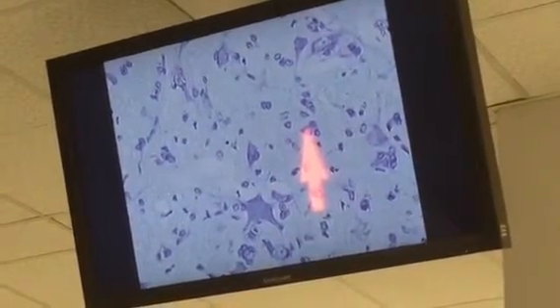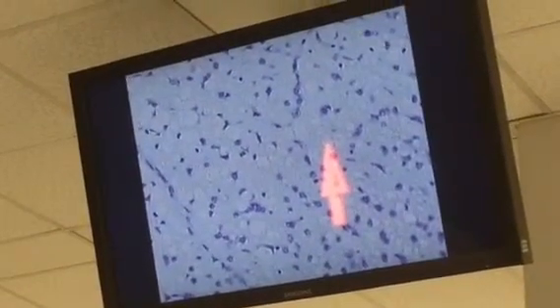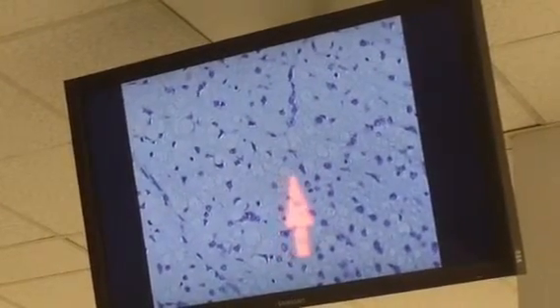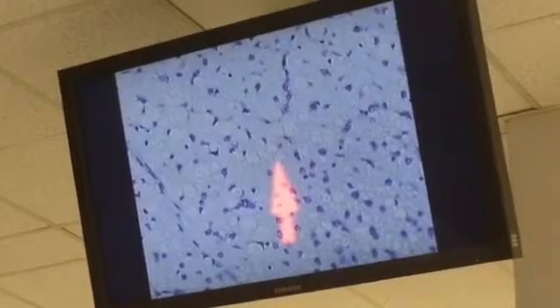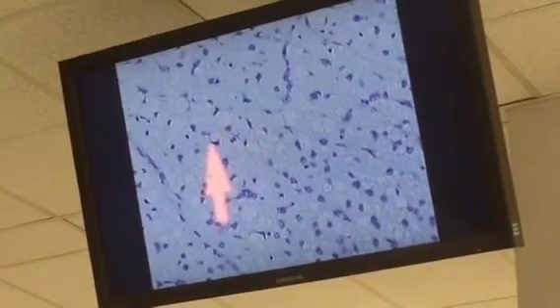We go out into the white matter. Okay, this is the gray matter. If we go out into the white matter, what do we see? Well, mostly we see light stuff. And every now and then we'll see a big hole with a little dot in it. And that little dot is an axon. And the light space is where the myelin used to be, wrapping around that axon. So there's lots of big holes with little dots in it.